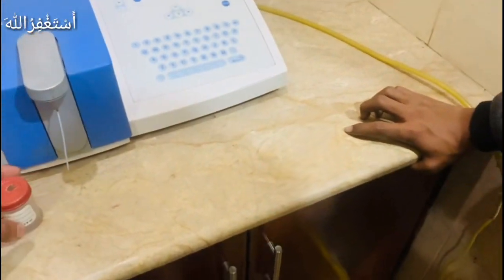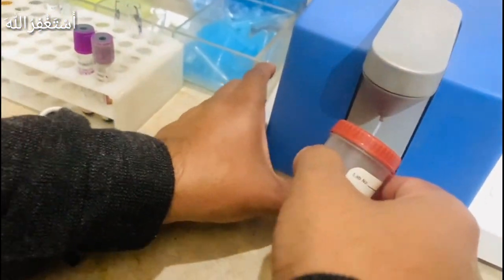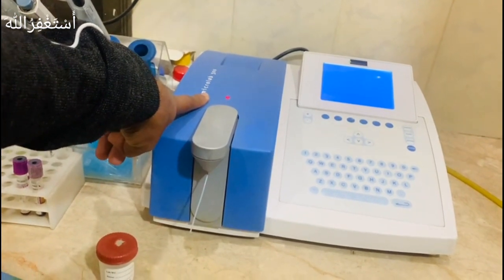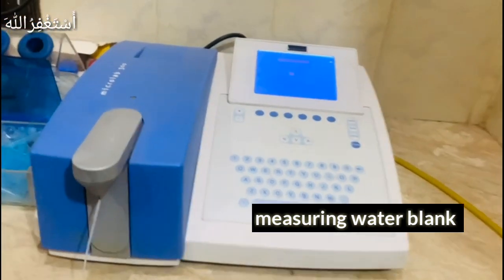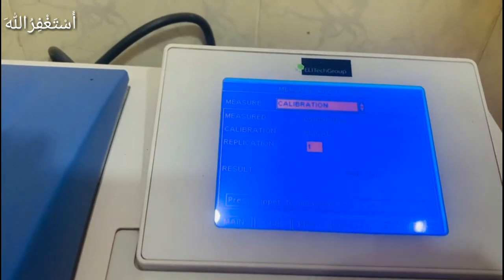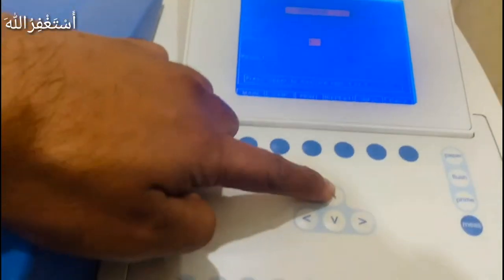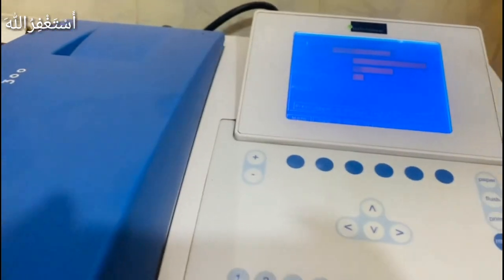Now we have water — just water — for the blank measurement. A light will come on, and until it does we will keep the water in. It will automatically close. Now it is measuring the water blank, and you can see it is on calibration. Calibration is set on the machine. There is a separate video specifically for calibration and how to set it. Now this calibration is set, and we will move to the next step where the sample will come.